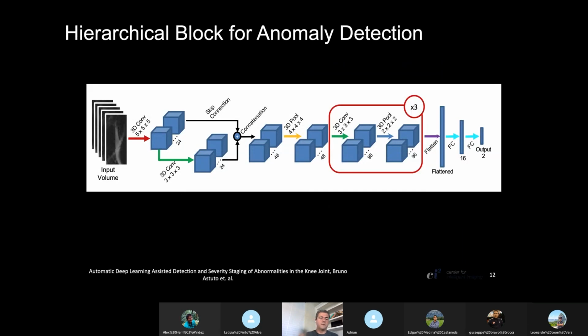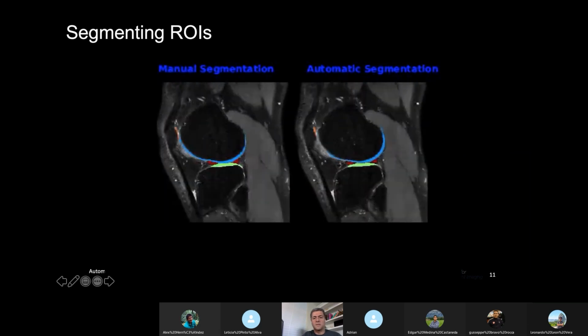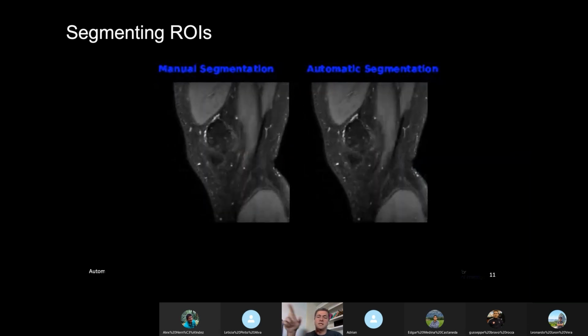Yes, we acquired data from HSS, which I think is in New York, and another orthopedic clinic in Spain called Clínica Centro. This video here is our segmentation model on one of these externally collected data sets. This image was collected from another institution on another machine, but with the same MRI sequence as I mentioned.